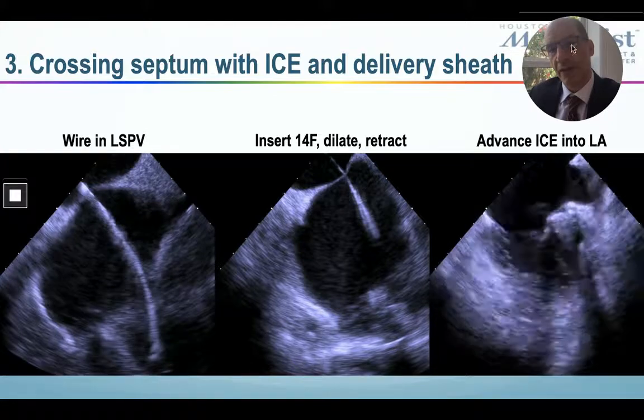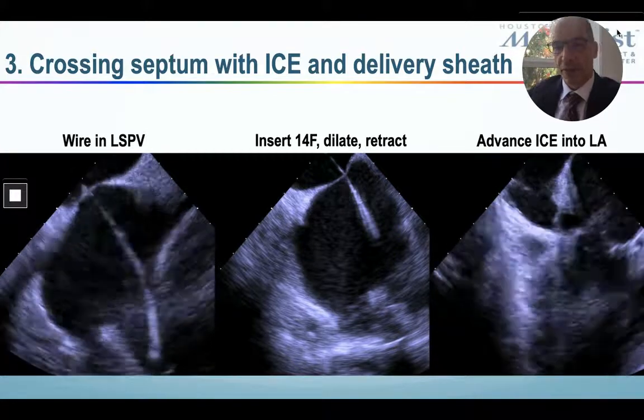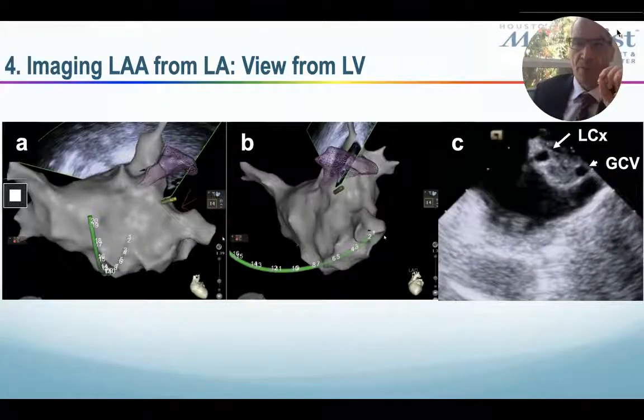Now you are in the left atrium, and then you will have these amazing views of the left atrium, of the left atrial appendage from the left atrium. There are several views that we've come up with and defined, although they're relatively straightforward. There's nothing really magical about what we've done. One nice view is the transmitral view.